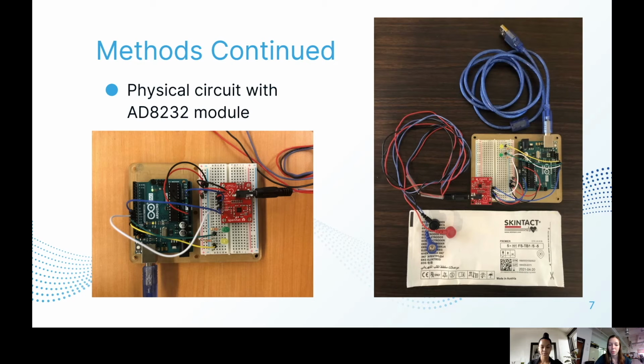The sensor cable allowed for transmission from 3 electrodes, so we used standard bipolar leads in an Einthoven's triangle placement. 2 electrodes were placed on the left and right side of the chest, and 1 was placed on the torso. By placing the electrodes closer to the heart, the signal comes through stronger and with less noise from motion artifacts.